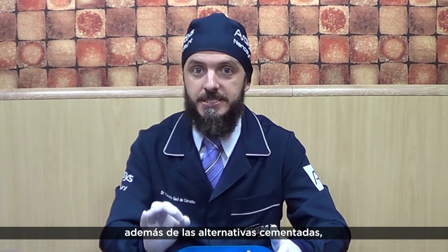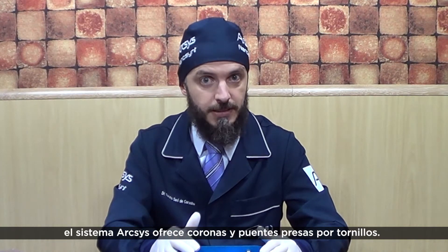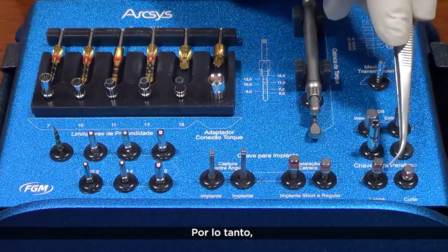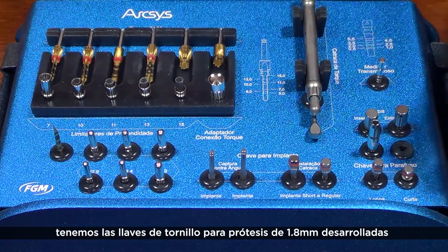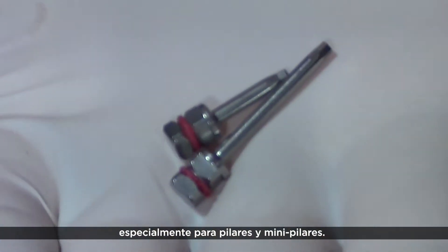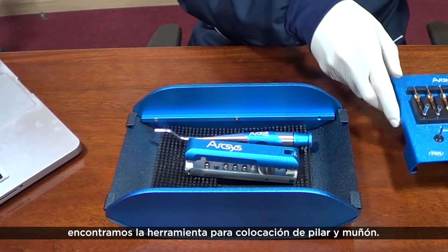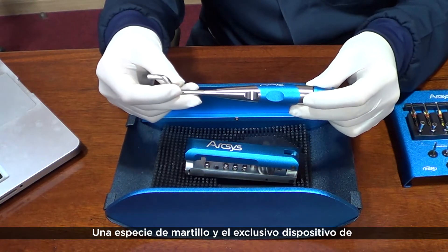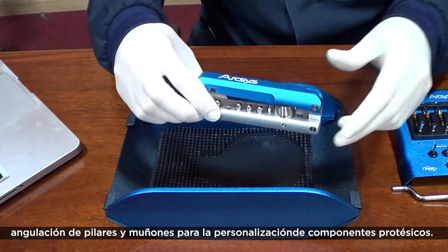As you know, besides cement-retained rehabilitation, Arcsys offers the possibility of screw-retaining crowns and bridges. Concluding this level, we have the 1.8mm prosthetic screwdrivers, developed specially for pillar and mini-pillar abutments. Under the tray, we find the abutment placement tool — a kind of hammer — and an exclusive abutment folding device for prosthetic component customization.